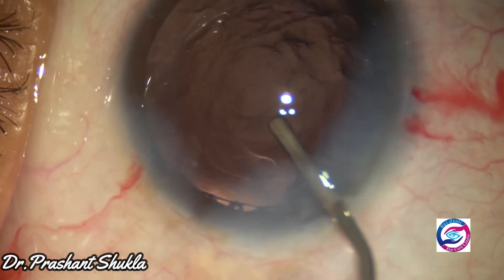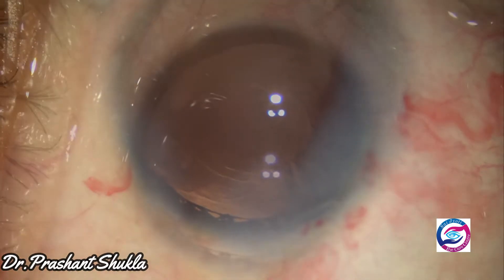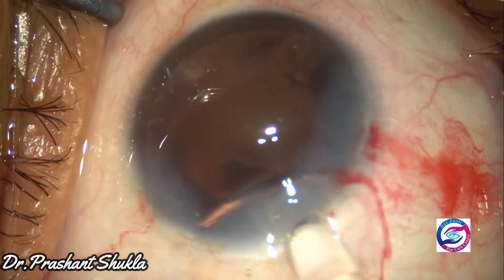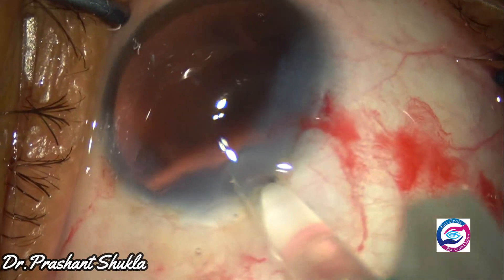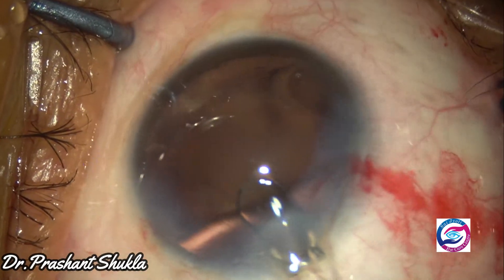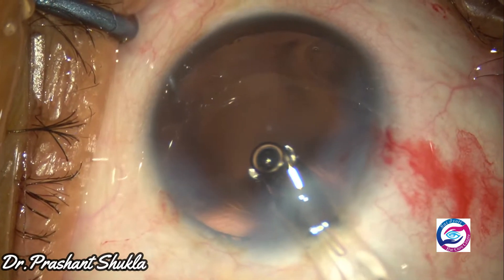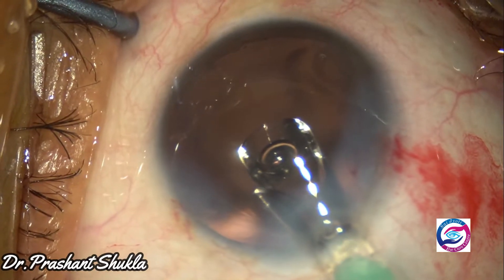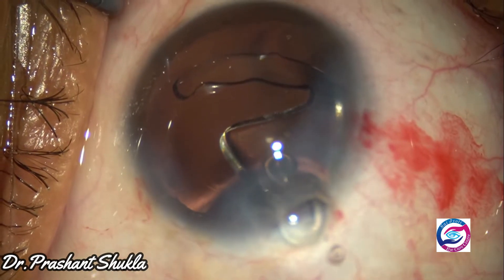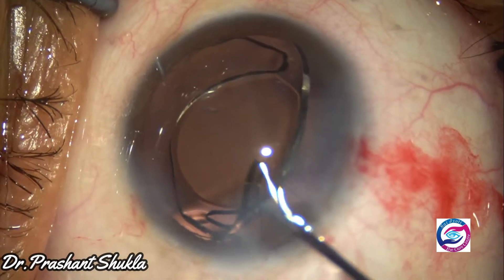The capsular bag is now being filled up with HPMC to make space for intraocular lens implantation. In this case I have selected a hydrophobic foldable intraocular lens with aspheric optics. The leading haptic goes into the capsular bag and the trailing haptic is now being dialed into the capsular bag.